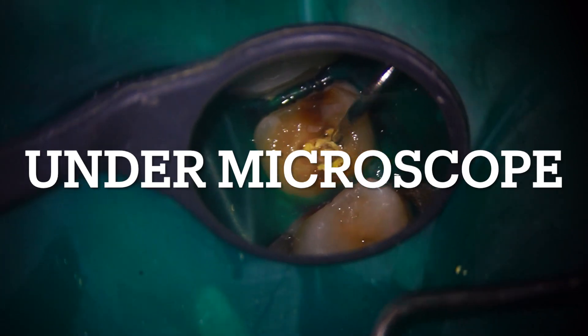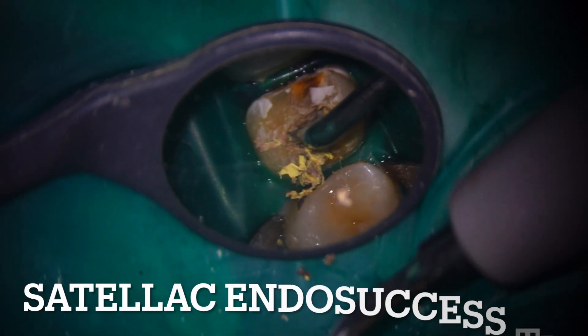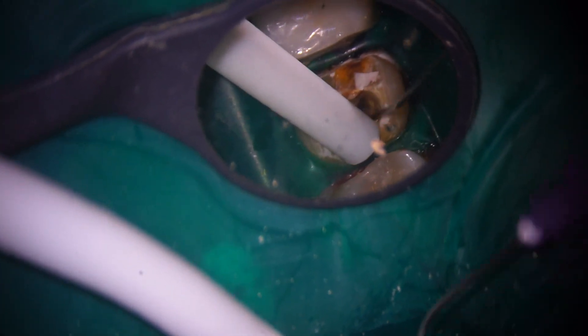Today we wanted to show you a re-treatment case. When we removed this restoration, we could see a lot of gutta-percha inside. We removed it using ultrasonic Satelec Endosuccess tips and then irrigated. We could identify a new canal which is MB2, which was missed in the previous treatment.